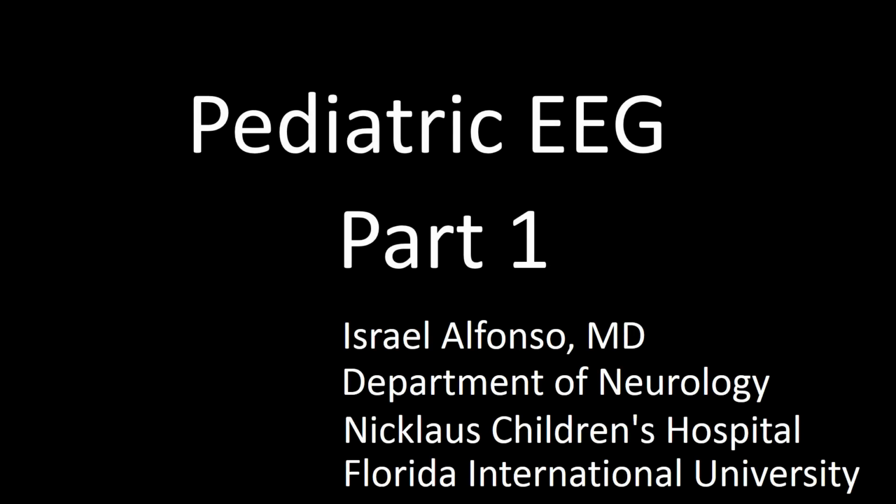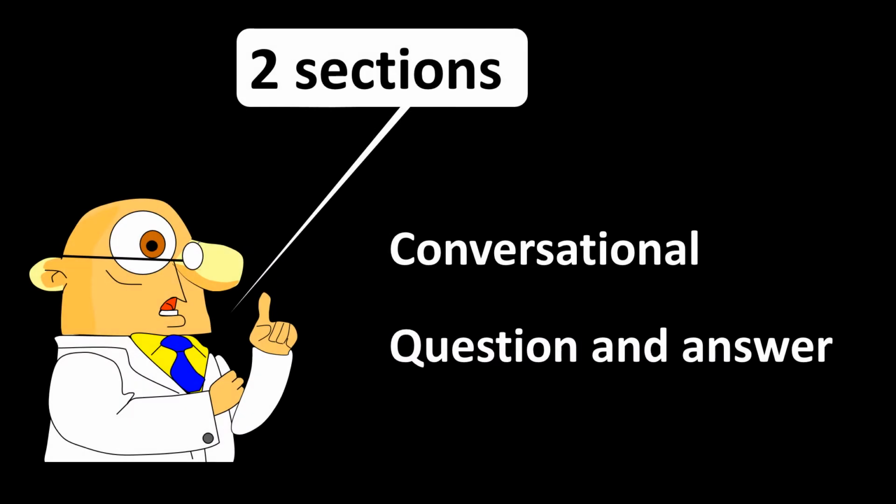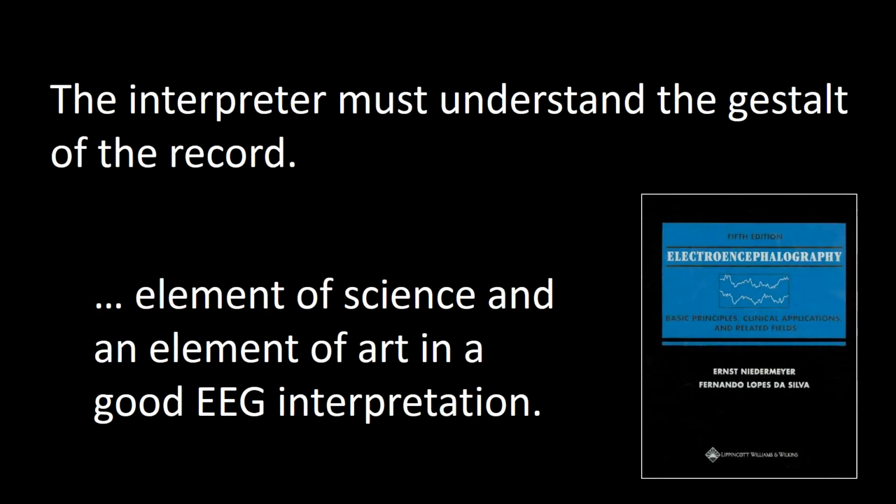This is the first in a series of talks about pediatric EEG. It will be conducted in two sections, a conversational and a question and answer section. The statements in this frame are fundamental concepts in the interpretation of EEG in general, but particularly when interpreting a pediatric EEG.